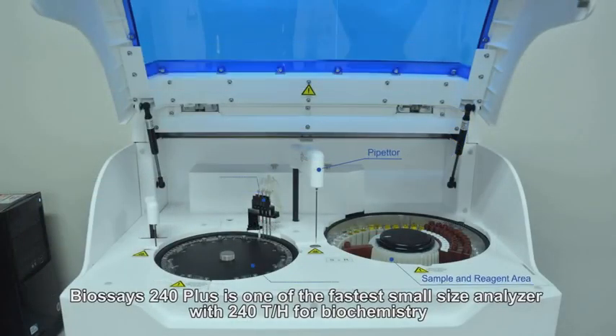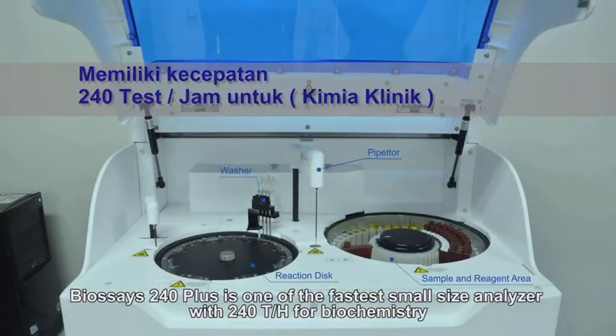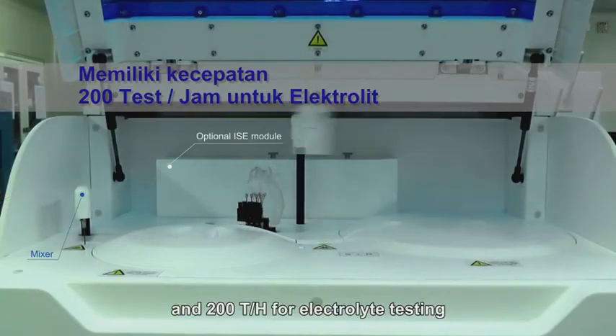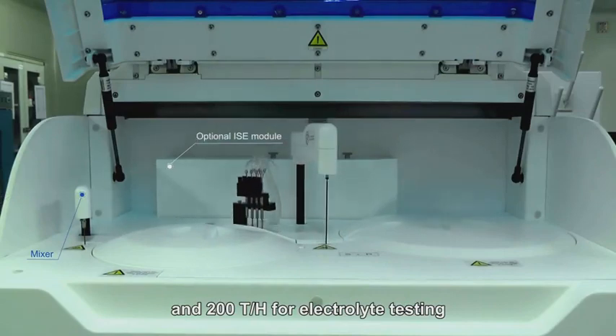BioSage 240 Plus is one of the fastest small-size analyzers, with 240 tests per hour for biochemistry and 200 tests per hour for electrolyte testing.